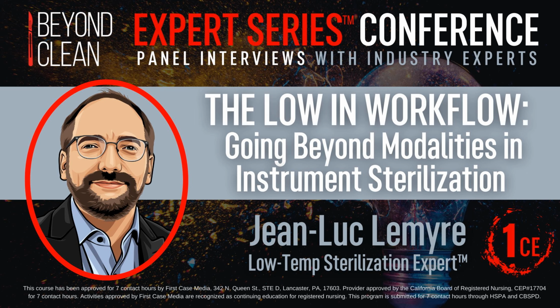Wow, yeah. And so I imagine that also brings some benefits with it as well, because when it degrades, you're left with just water and oxygen, right? Yeah, absolutely. That's a very important point for peroxide. It's good at sterilizing and killing bugs, but the byproducts are basically water and oxygen itself. So it's a very safe byproduct. That's one of the good reasons to use it in low temperature sterilization and other disinfection uses as well.